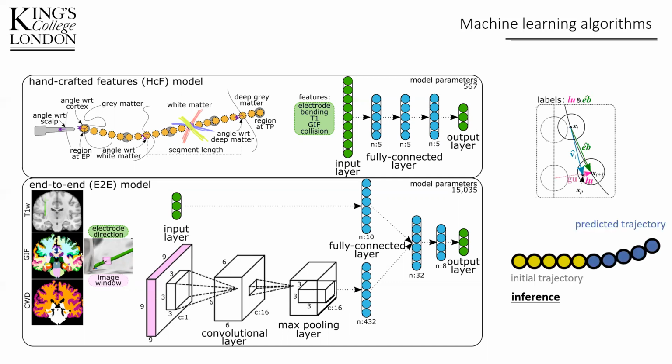During inference, we regress either local displacement or electrode bending to compute the next interpolated point up to a specified depth. And we also use the dropout layers to compute epistemic uncertainty of our predictions using MC dropout over a total of 204 passes.